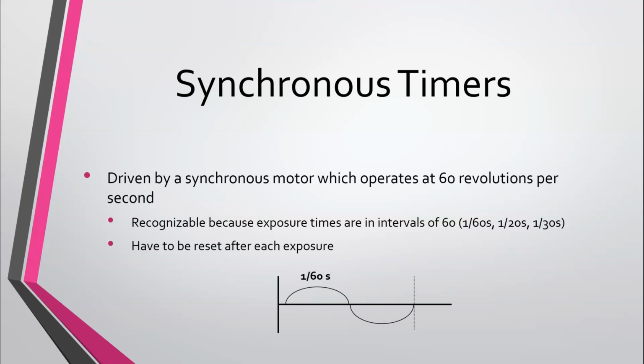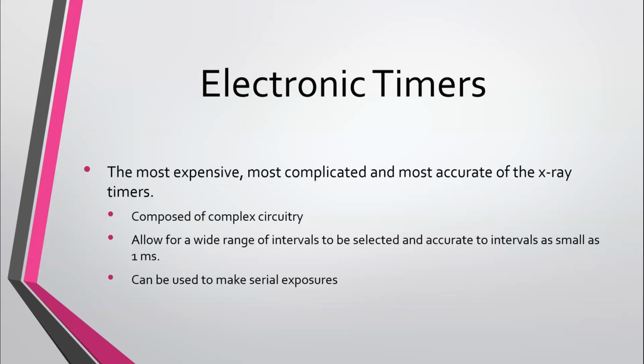So driven by a synchronous motor, which operates at 60 revolutions per second. So these synchronous timers are recognizable because the exposure times are in intervals of 60. So 1/60th, 1/30th, 1/20th. So they have to be reset after each exposure.